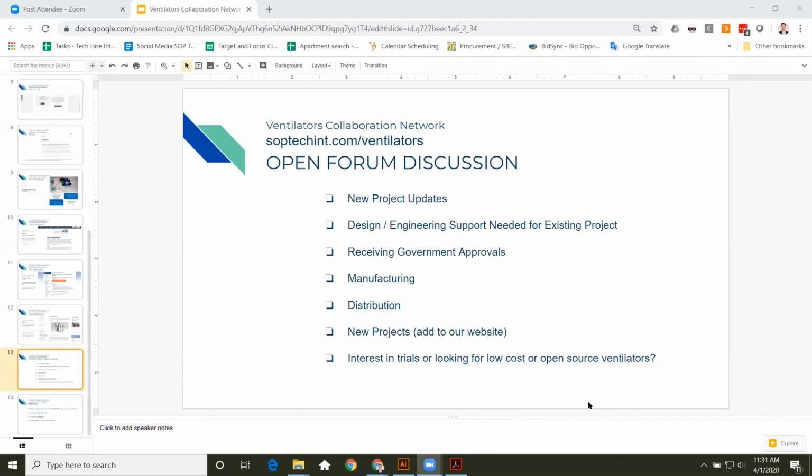Another concern we have is motors. Right now, we're just oversizing stuff for our vents that use motors or steppers, and getting some sort of consensus on motor requirements across these ventilators, especially with regards to heat. That's a concern I think we're going to see a lot of.